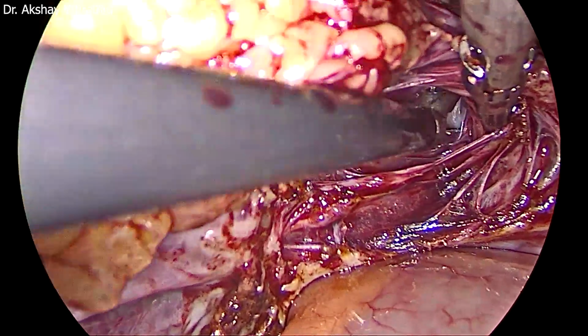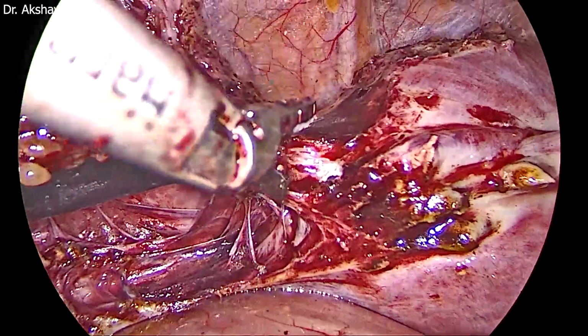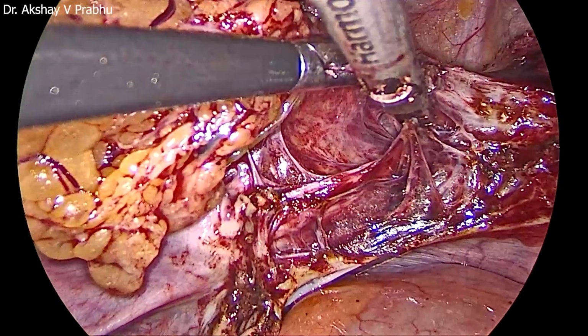I'm going anterior to the cervix. Bladder is above my instrument. I put the bladder on stretch, and with that understanding, I'm just trying to release the adhesion band. Now this is the adhesion band which is directly stuck to the previous cesarean scar.